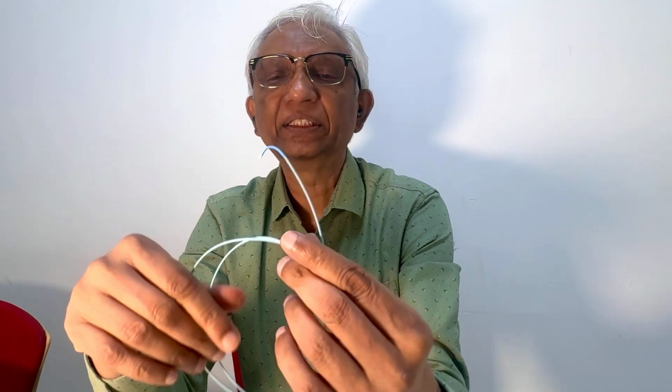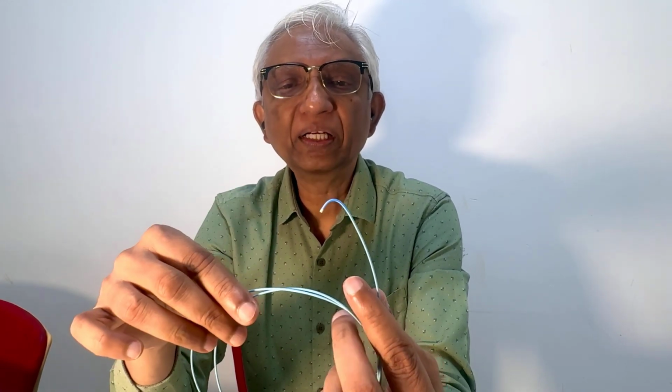So we are taking you through some basic fundamentals of catheters. We have told you about some basic shapes of catheters, and then I told you how it can be done. This is also an interesting shape. It looks almost like a Bernstein, but it's got a tighter curve. It is called the internal mammary artery catheter. But remember, you can use it very well to cross the bifurcation. You can also enter some other vessel where you need a tight angle, but definitely it's a very good catheter to enter the internal mammary artery.